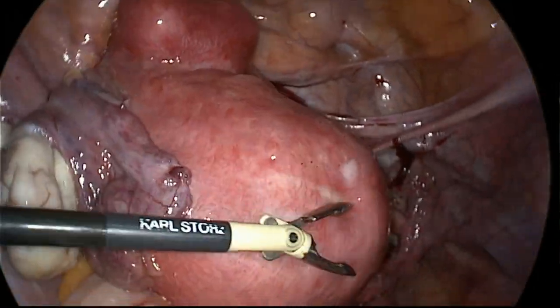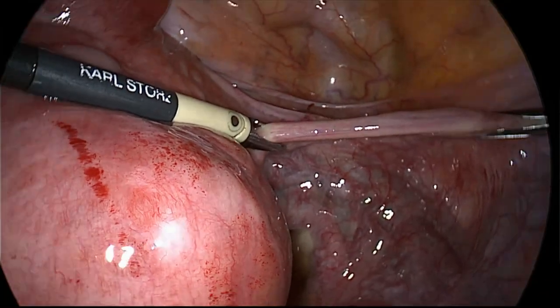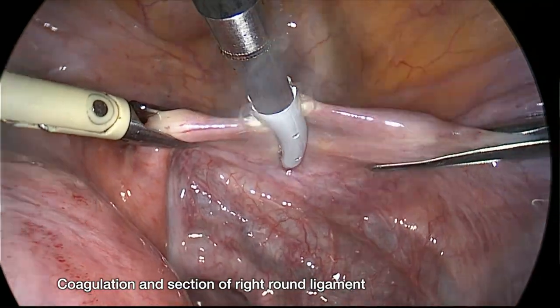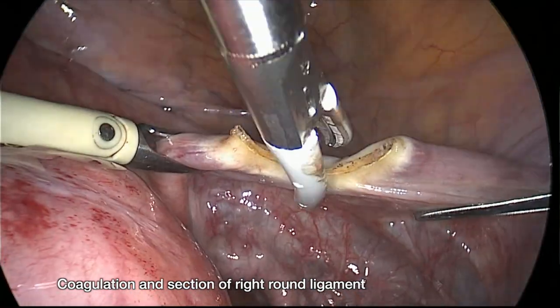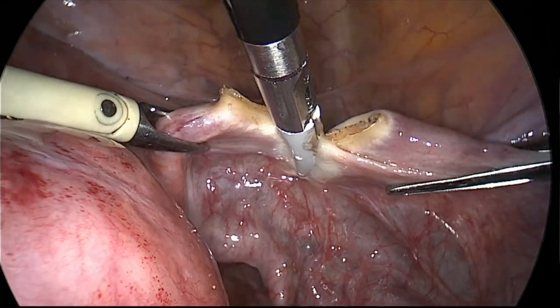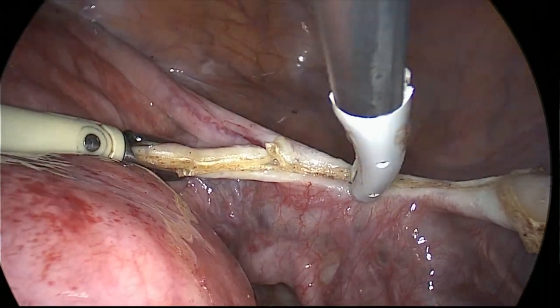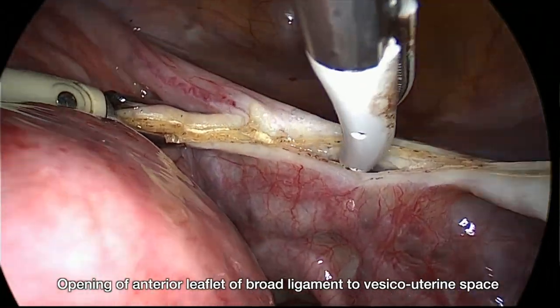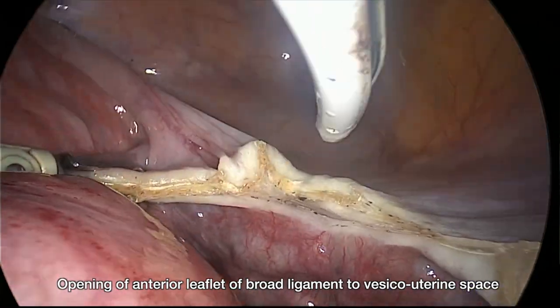Then we move to the right side, again performing coagulation and section of the right round ligament. With this device there is almost no thermal spread — it causes fusion of the tissues. We then open the broad ligament and on this side we do exactly the same as we have done on the left side.